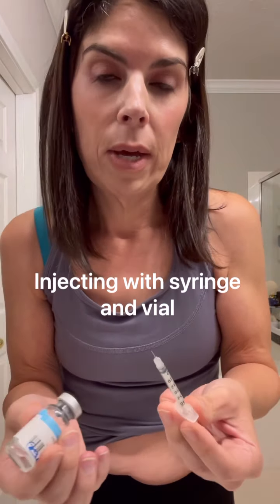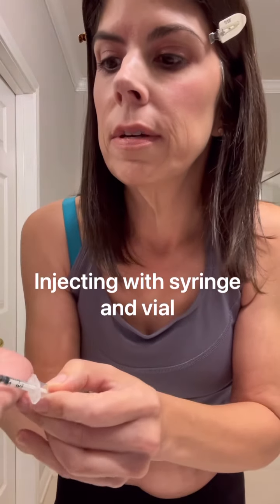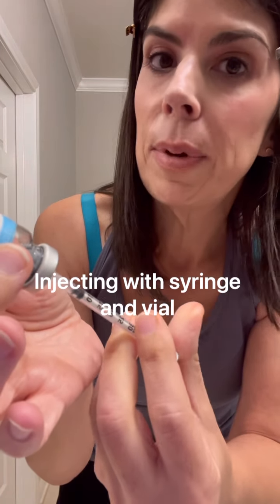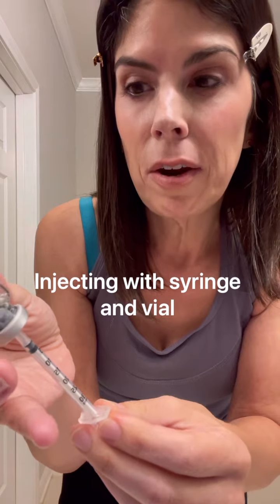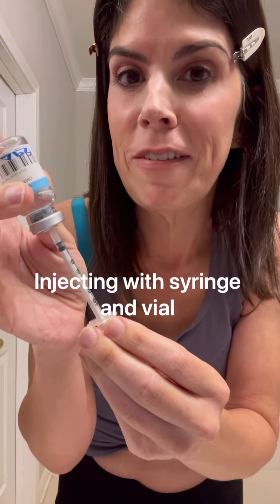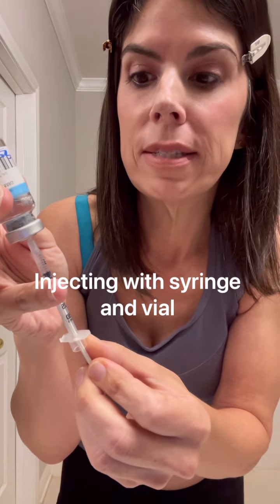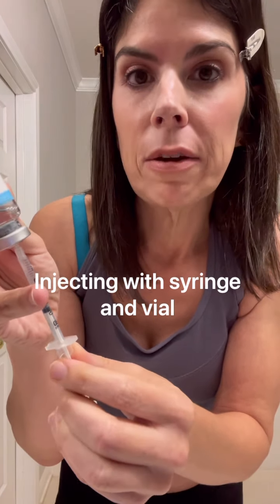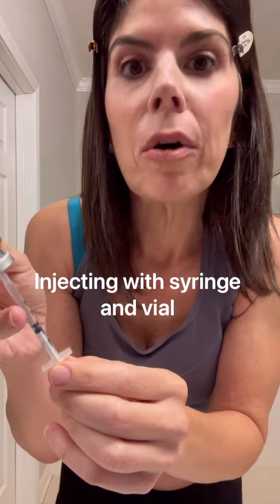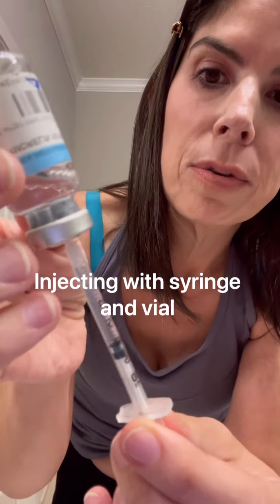Another technique, especially with new medicine or a new syringe, is to first pull a tiny bit of air into the syringe and inject that air into the vial before drawing your medicine. Don't inject too much air — if you inject too much, the vial can burst. Just a little bit of air helps propel the medicine into the syringe more easily. This is especially helpful when you're trying to get the last bit of medicine out of a vial. Draw the medicine to the correct marking — in this case, point two.